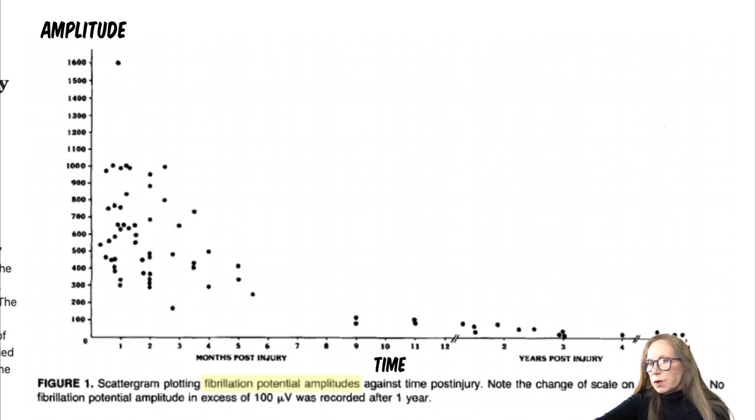And the amplitude of the fibrillations is high, and then you're in this golden period where you will see fibrillations present until you start to get to 6 months, and then even as you pull out from 6 to 12 months, you see less and less of the fibrillation potentials there, and they're moving over time to a point where finally they're gone. So really from this study you can see how critical that window is in the first 6 months, and less as time goes on.